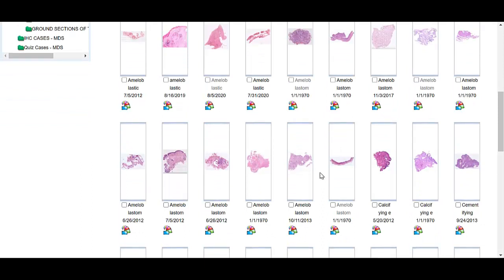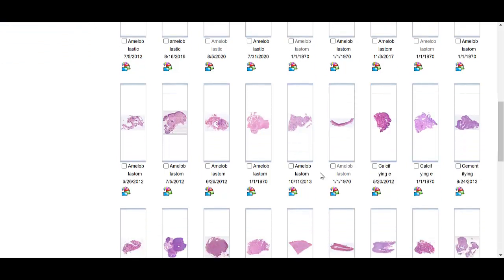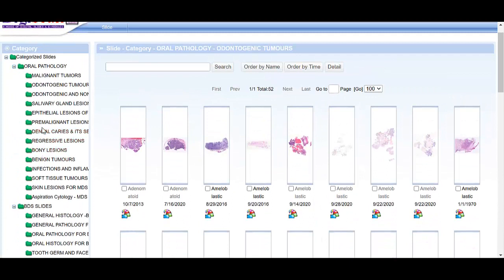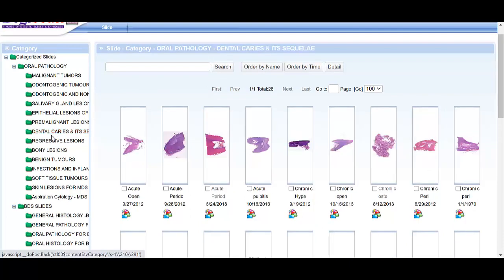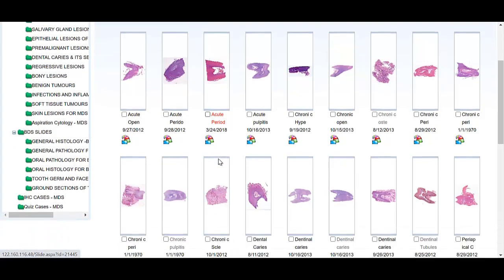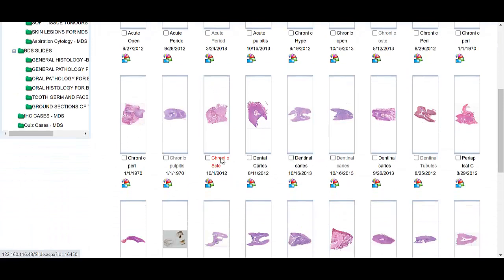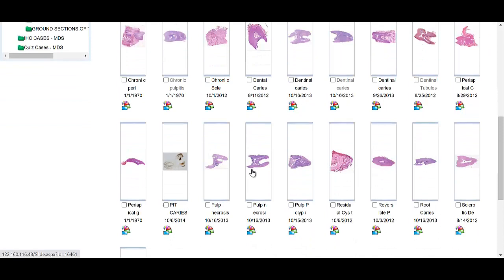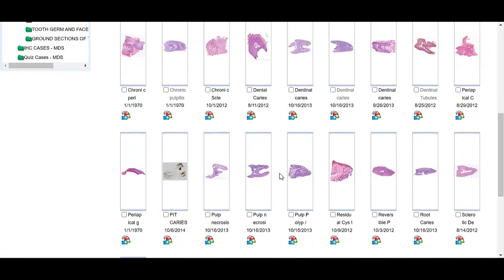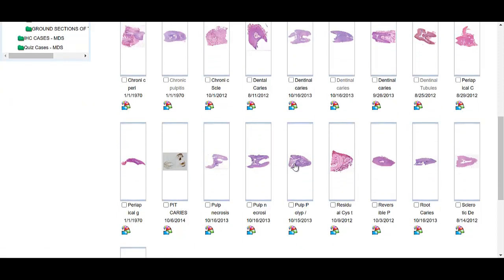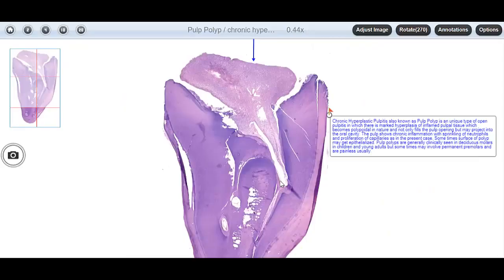In ameloblastomas, all variants are present in these sets, which are very helpful. Suppose we want to go to dental caries and its sequelae — we have acute abscess, apical abscess, pulp abscess, and chronic pulp abscess. All the sequelae of caries are demonstrated in this set. We also have a very unusual case of pulp polyp, which is not easy to find — here we have open pulpitis with formation of a polypoidal mass of the pulp, which is pulp polyp, also called chronic hyperplastic pulpitis.